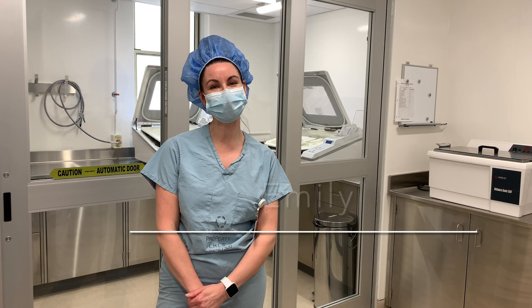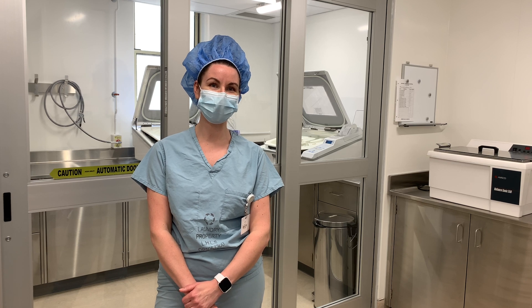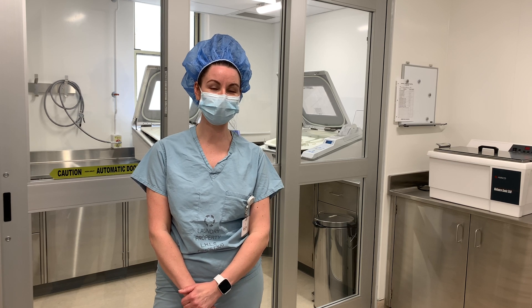Hi everyone, my name is Emily, supervisor of MDRD. Here we are at the new endoscopy decontam area in Clinton.